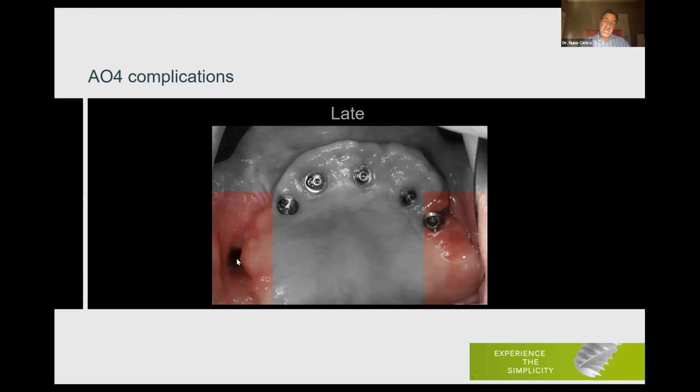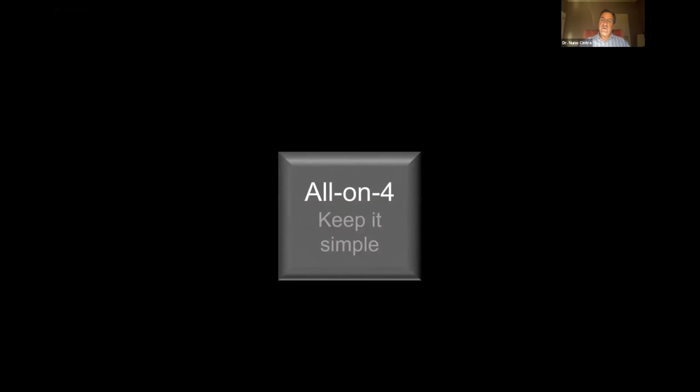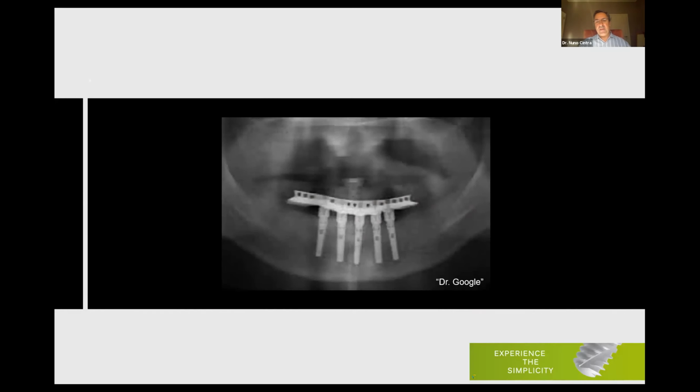I tried to close them once. I was not able to close them. Other colleagues tried to close them. They were not able. So this patient lives with this rehabilitation with two chronic sinus communications due to zygomatic implants. So we are coming towards the end, and my message to you is please keep it simple.